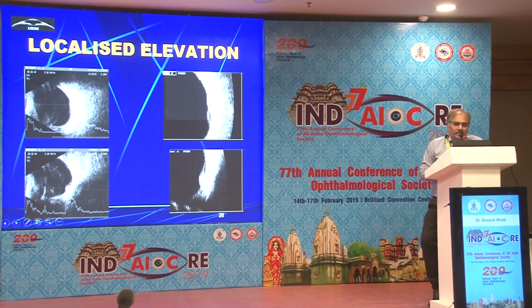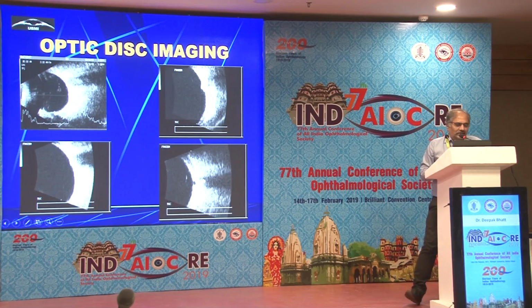So I used a 20 megahertz probe in this. You can see that this is a retinal elevation with some amount of fluid over there. So this is not a mass lesion, whereas this remains solid on a 20 megahertz. So this is a small solid tumor which needs follow up. This is how the resolution helps.